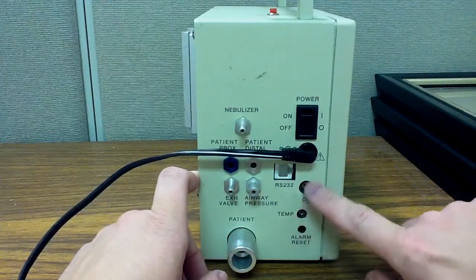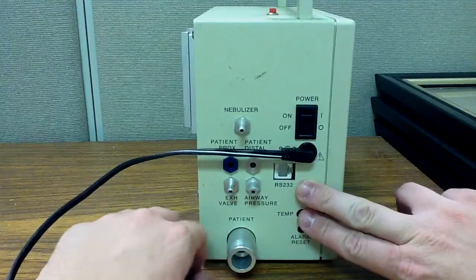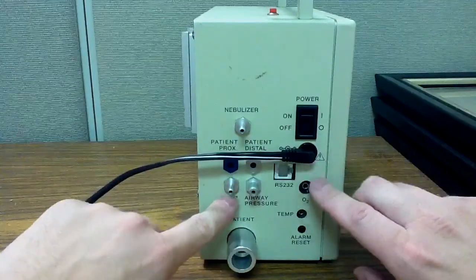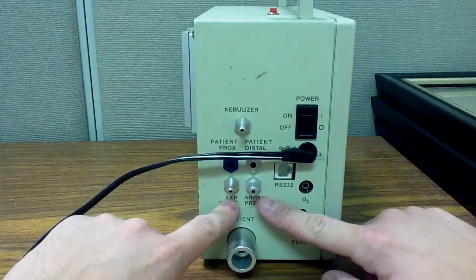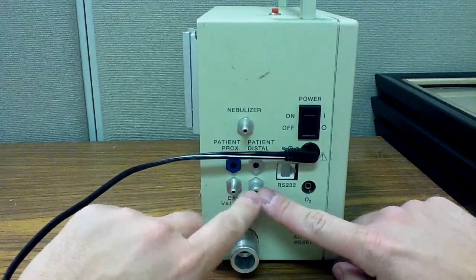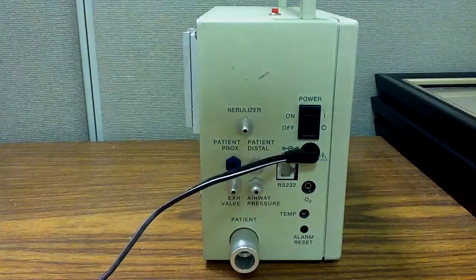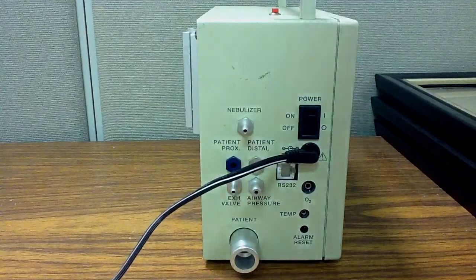There is a temperature probe here, an O2 probe. We generally did not use these, however. This is your exhalation valve and your airway pressure. So these are your transducing lines that should be attached to the ventilator circuit. I'll show you an example of those on the ventilator circuit here.